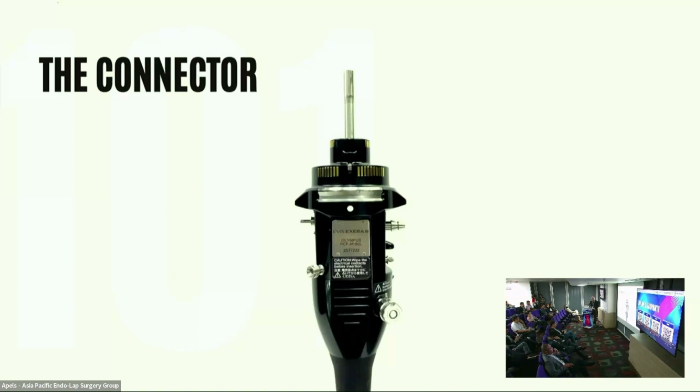There's a portion here wherein after every procedure they check for air water leaks. I mean leaks inside the tube of the scope, because our lives as endoscopists, or as a minimally invasive surgeon, wherein you use this every day, we have to keep track of how it is maintained. Because once it's broken down or destroyed, then we don't have anything to use. So we take care of these scopes just like we take care of kids or our next of kin.